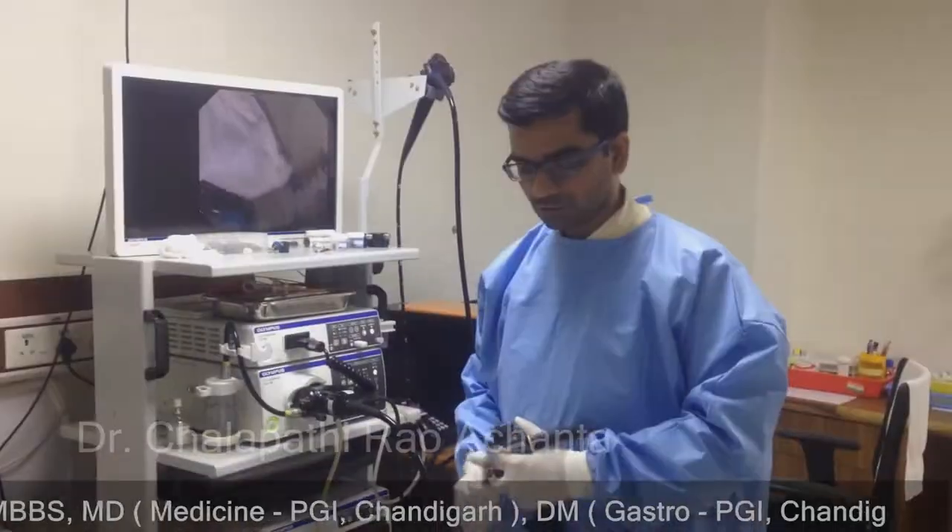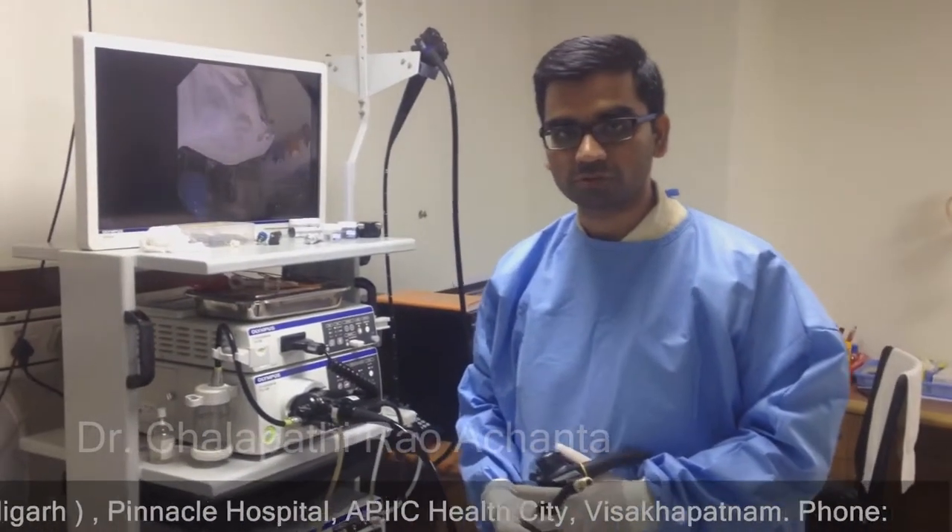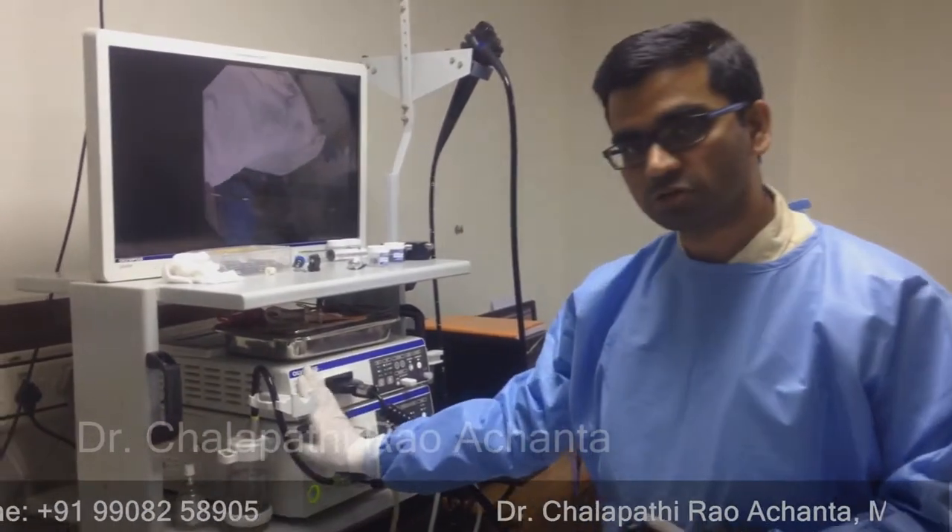I am going to talk about endoscopic ultrasound. This is an endoscopic ultrasound. This is a hybrid scope. This is our endoscopic equipment.